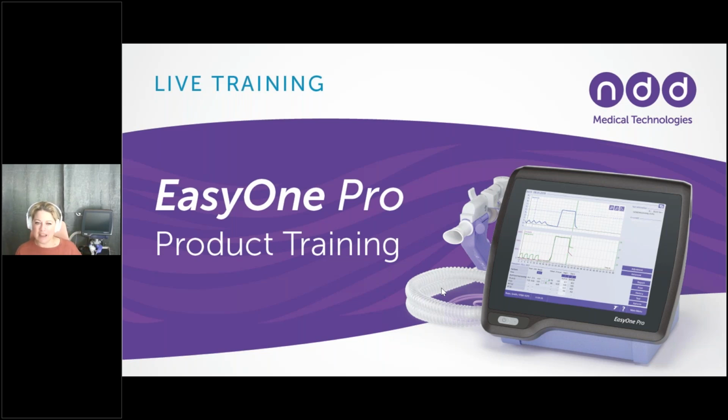We're always so glad that so many of you come out each and every month to learn about our products and learn more about how to be a better tester. And today we are looking at the EasyOne Pro and Pro Lab, focusing on the DLCO test.